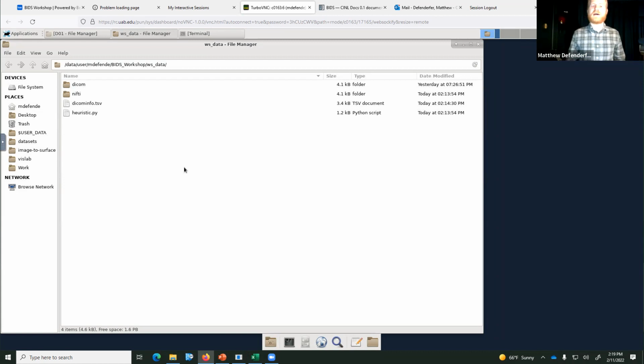And they just didn't want that to clutter the BIDS formatted directory. And I'm pretty sure that hidden files and folders are not accounted for when you're validating your BIDS data set to make sure that everything is formatted correctly and stored correctly. I'm pretty sure it ignores all hidden files and folders, so they made it a hidden file so that you didn't run into any issues with that down the line.